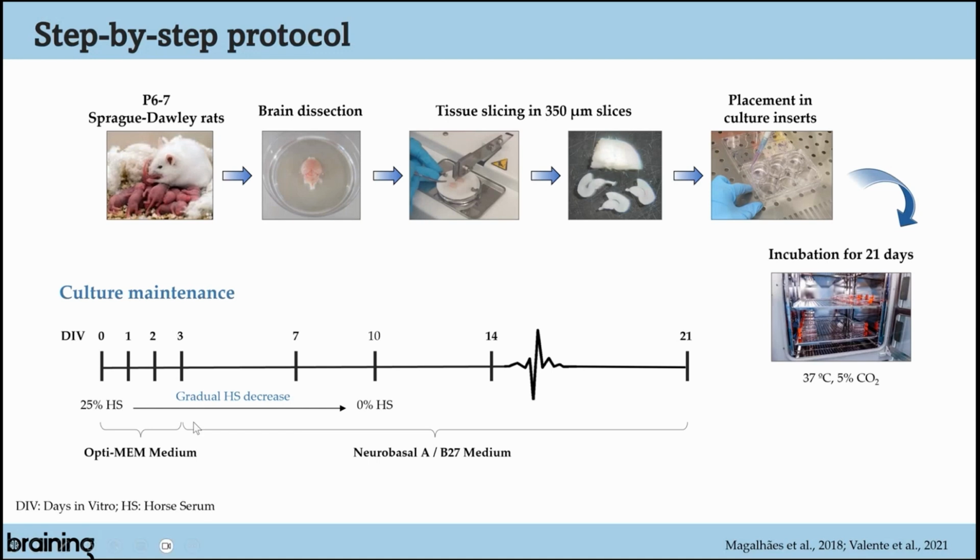So I removed the whole serum and just put the slices from Optimem to Neurobasal. Unfortunately, that didn't work. Slices simply died. No slices at all after the weekend. Usually these cultures are prepared on Tuesday. I was all happy changing the medium to Neurobasal A and going off for the weekend. And on Monday, the slices were all dead.